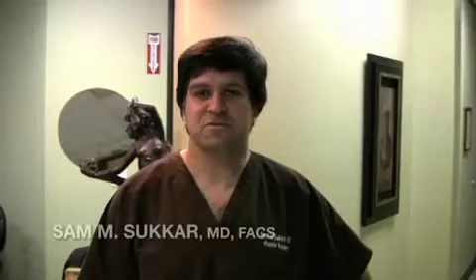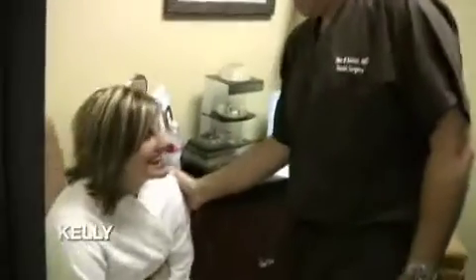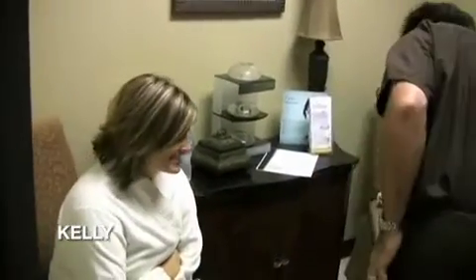Hi, I'm Dr. Sam Sukkar. We're getting ready to go in and mark our patient, and we're going to be doing local liposuction, totally under local anesthesia. What does that mean? It means no general anesthesia or IV sedation. The patient is completely awake and can talk during the procedure, talk on the phone, read a book.